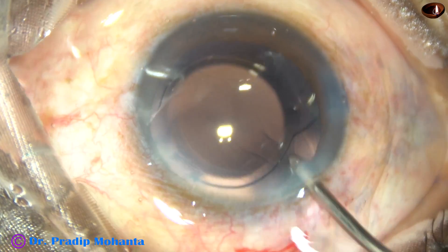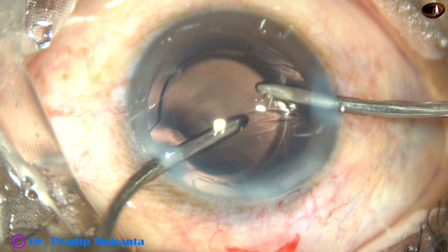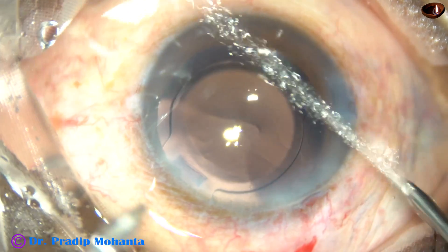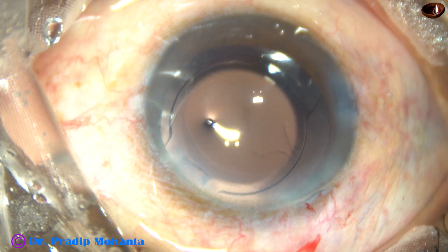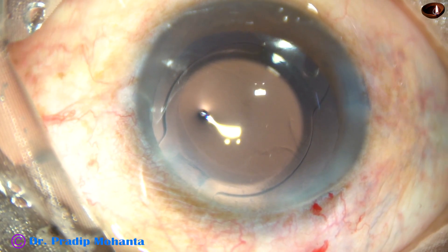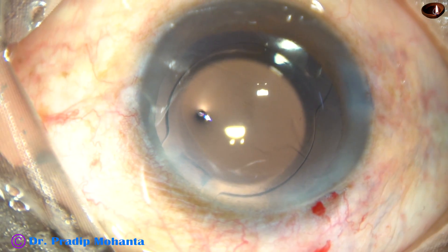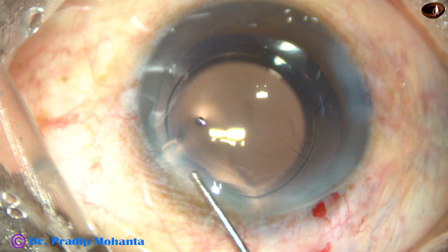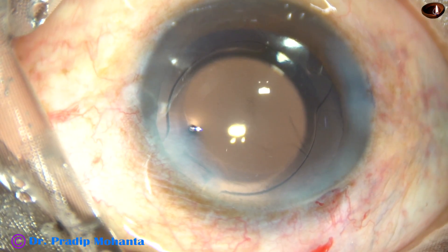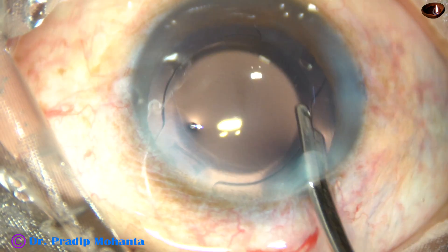Irrigate the anterior chamber and the capsular bag very nicely so that all the viscoelastic substance comes out, then use irrigation and aspiration together. Thorough removal of viscoelastic substance takes a little time and you should give that time. Now I am going to inject a bit of moxifloxacin and then use balanced salt solution to hydrate the corneal stroma on either side of the side ports. The corneal stroma becomes thick and the stab wounds close by apposition of the anterior leaf and the posterior leaf.